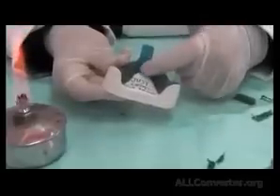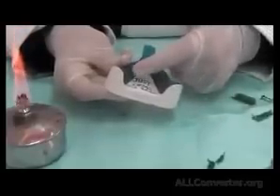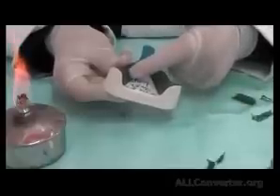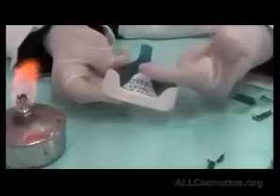So once more, protrude the tongue, it would reduce the thickness of the material. Go with the tongue to the left and right, it will reduce the sulcus depth here. Pushing the tongue against the palate in the posterior part will mold the length of the anterior area. So the lingual frenum will be stretched.